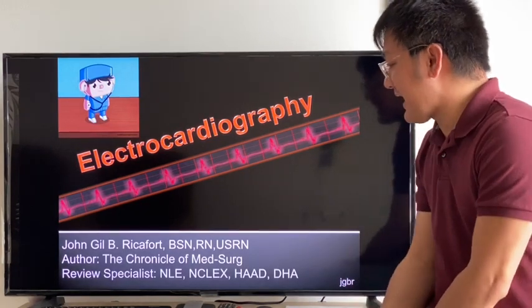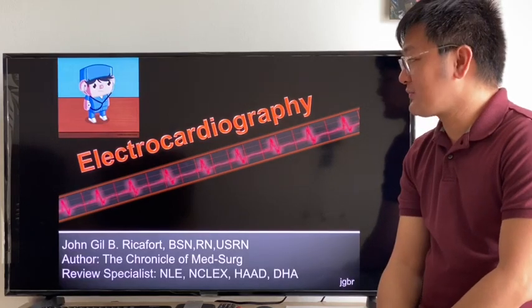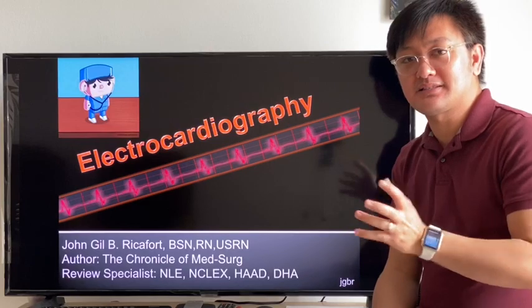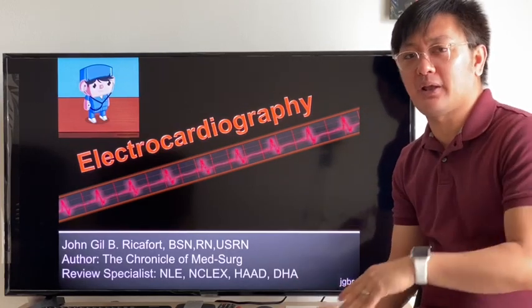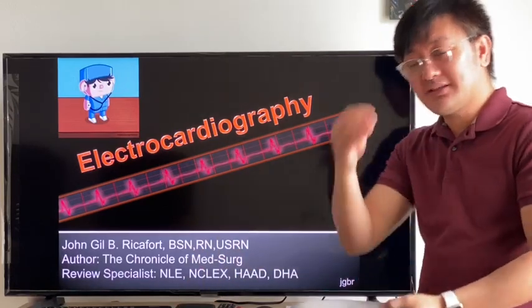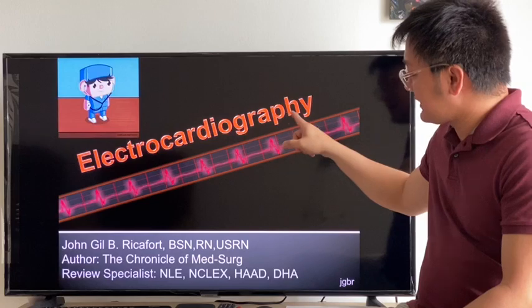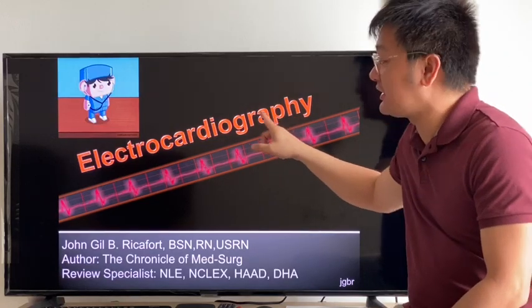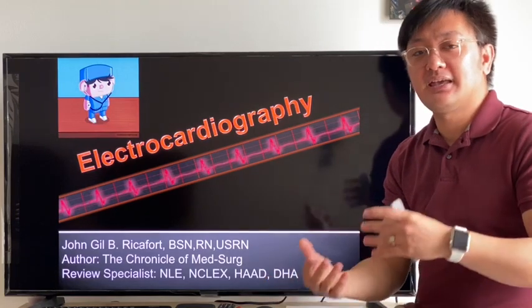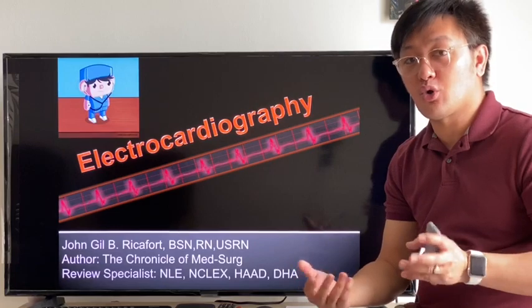And since I don't have any whiteboard here with me wherein I can write, I might as well jot down or take notes of some of the important things for electrocardiography, and you can replay as often as you want. Okay, so let's begin. Electrocardiography refers to the graphic illustration or presentation of electrical activities in the heart. It is a test that records electrical activities in the heart. It will not record contraction.